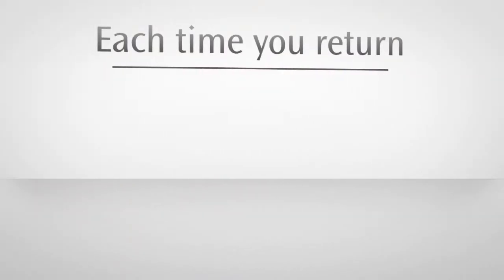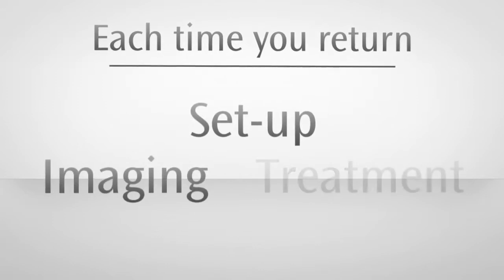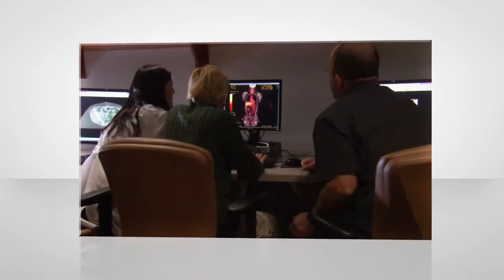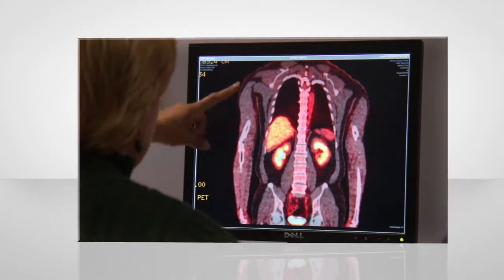Each time you return for treatment, you'll repeat the process of setup, imaging, and treatment until your course of therapy is complete. Your treatment team will continually review and collaborate to make any necessary adjustments to accommodate tumor shrinkage or movement during the course of therapy.